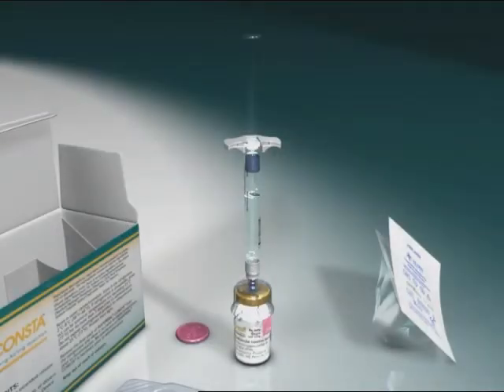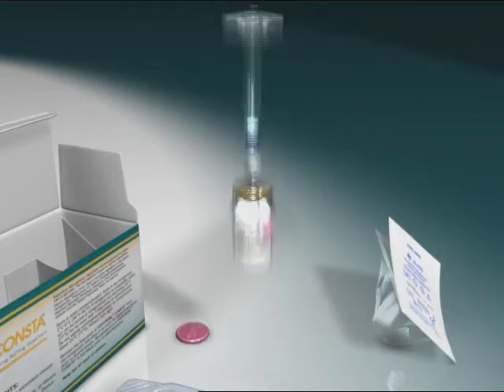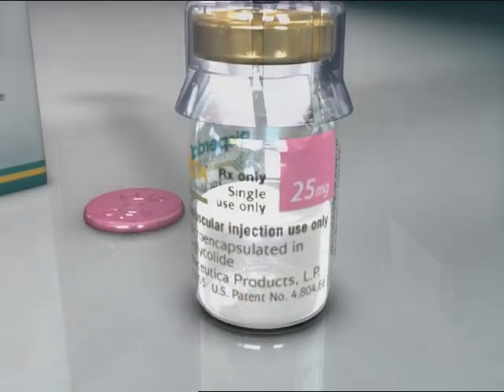Next, inject the entire contents of the syringe containing the diluent into the vial. Shake the vial vigorously while holding the plunger rod down with the thumb for a minimum of 10 seconds to ensure a homogeneous suspension. When properly mixed, the suspension appears uniform, thick, and milky in color. The microspheres will be visible in the liquid, but no dry microspheres should remain.